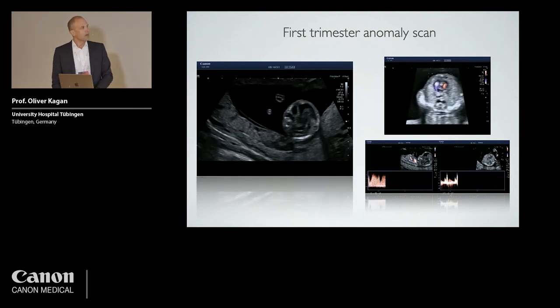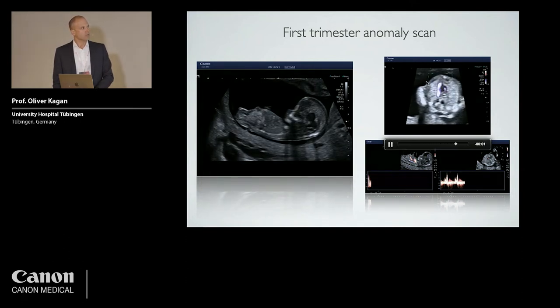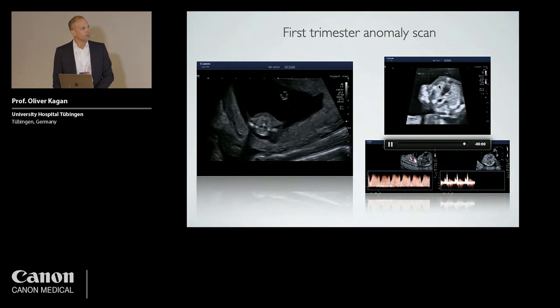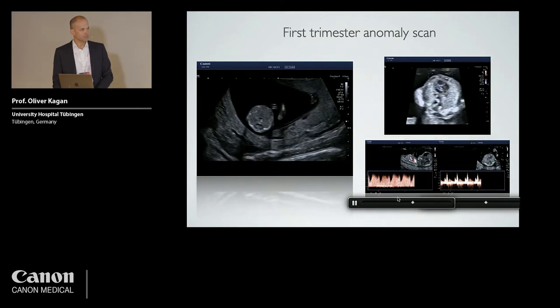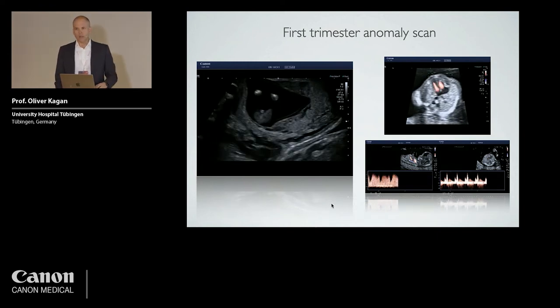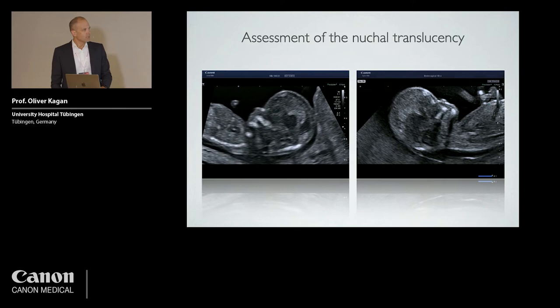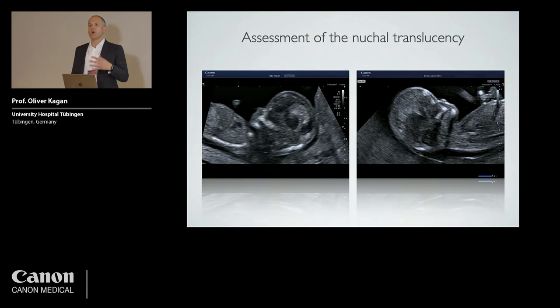If we focus now on the heart, and by the use of color Doppler, you've got images that are close to the second trimester, and you can see that both the left and the right heart look normal, the outflow looks okay from the aortic and the pulmonary artery. And by the use of pulsed Doppler waves, again, you've got so many tools to identify cardiac defects. So in 30 seconds, you cover all kinds of major defects, or at least half the major defects. And don't forget the assessment of the nuchal translucency, because nowadays, again, the nuchal is challenged by saying, well, why do I need a nuchal?